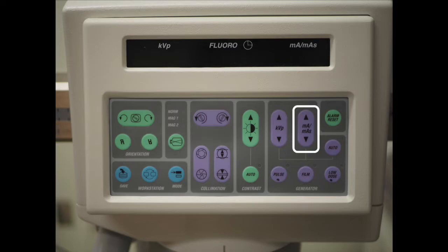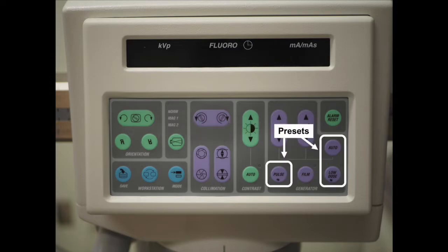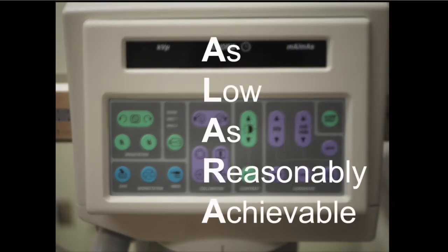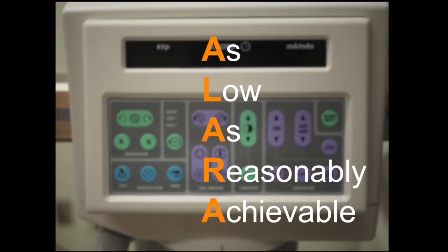The milliamps of the X-ray beam can also be adjusted. Higher milliamps are needed for viewing dense or thick tissues. However, typically we do not need to adjust the KVP and milliamps ourselves, but can use presets to help keep the radiation dose as low as reasonably achievable, or ALARA.